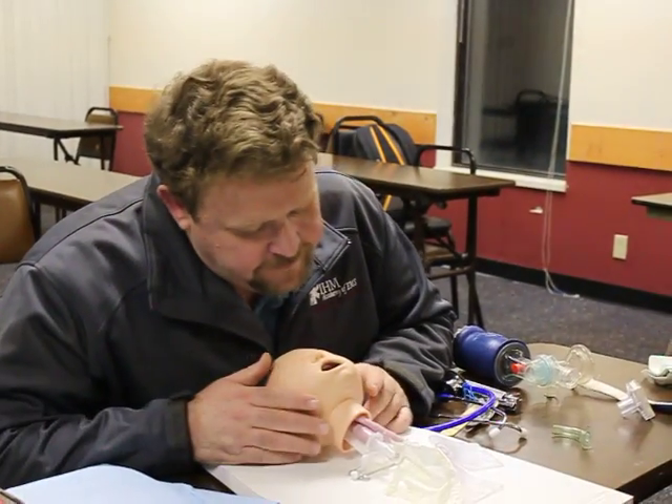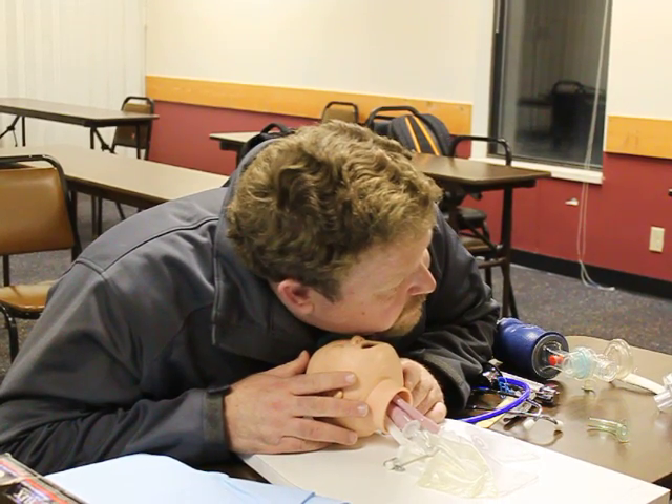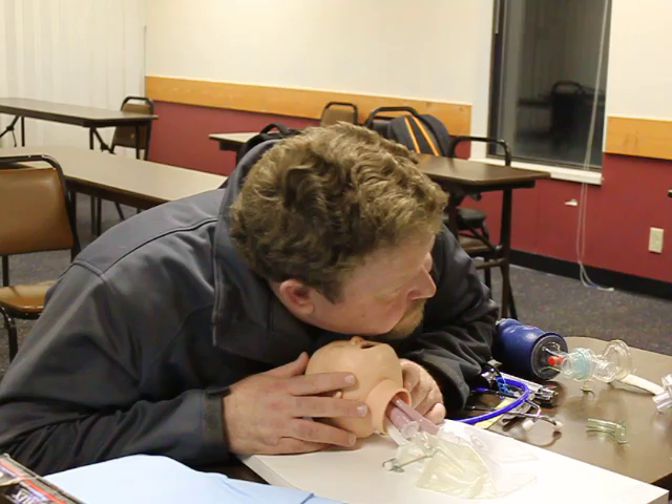Baby, baby, are you okay? I'm going to go ahead and properly position the head. Look, listen, and feel for five, no more than ten seconds. Your patient does not appear to be breathing.